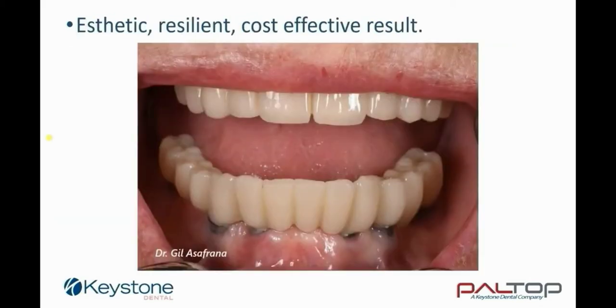The use of a hybrid composite with high tensile strength offered an aesthetic, resilient, and cost-effective result. Taking advantage of such a digital workflow is beneficial to the clinician, dental technician, and patient.